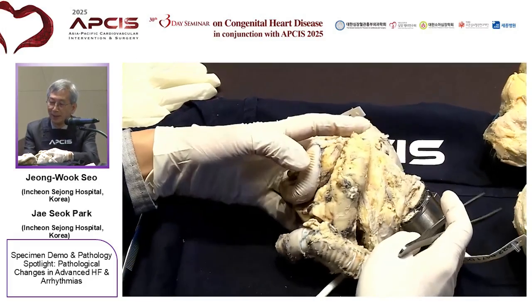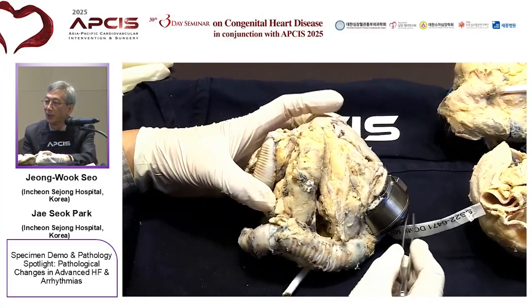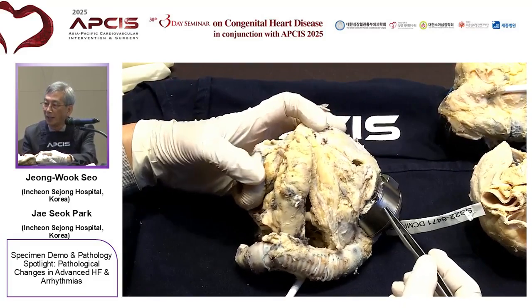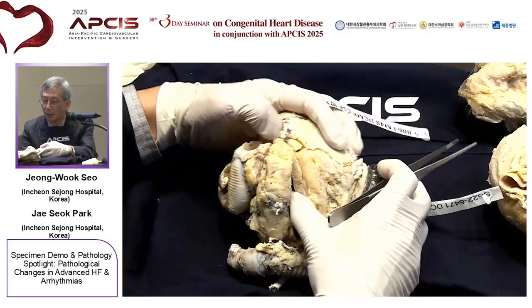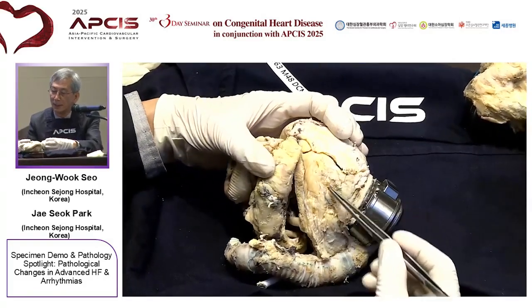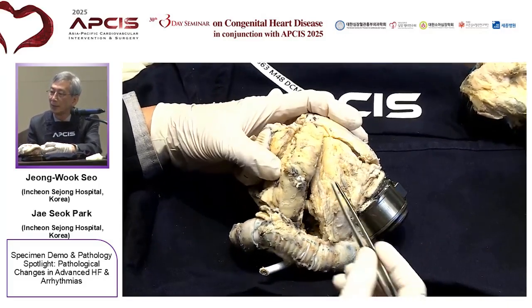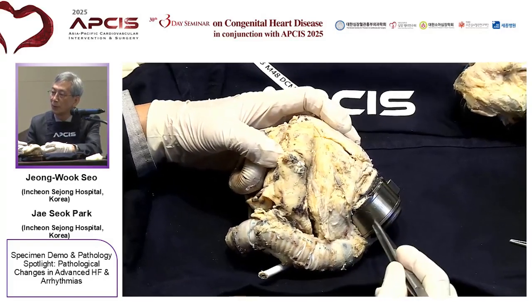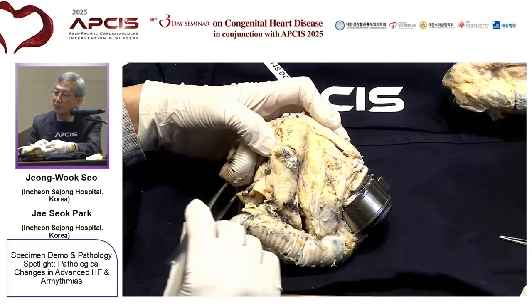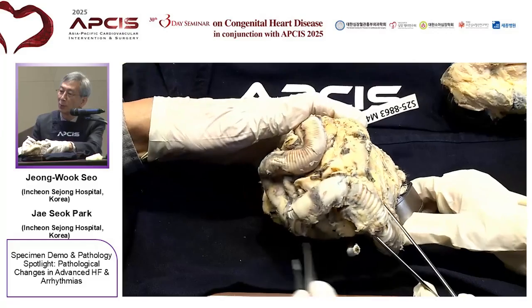Okay. This is the heart we have shown by PowerPoint slide. So we are looking at the LVAD from the left ventricular apex. This is the left ventricle. There is an anterior descending coronary artery. This part is the right ventricle. This is the conduit from the LVAD to the ascending aorta, which looks very tortuous.